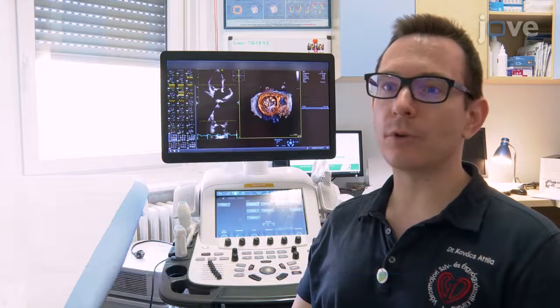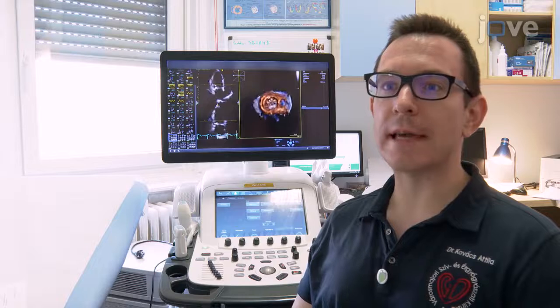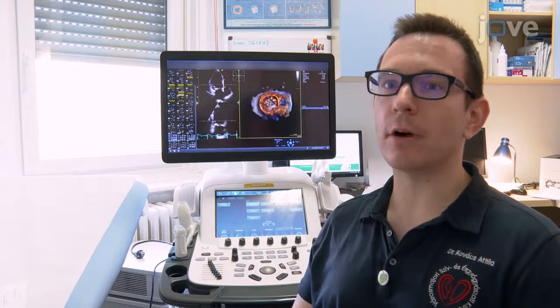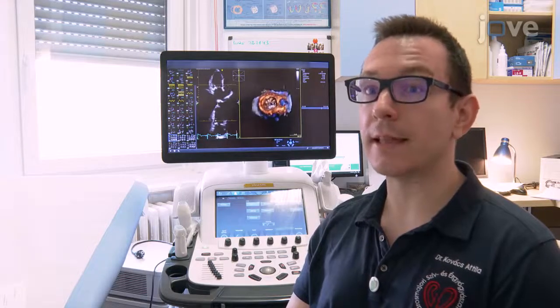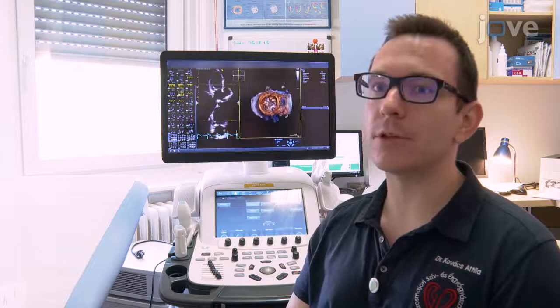3D echocardiographic assessment of cardiac structure and function is a breakthrough innovation in cardiology. Quantification of left ventricle morphology and systolic performance is the single most important step in every echocardiographic protocol. 3D echocardiography-derived left ventricular volumes and ejection fraction correlate most closely with gold standard cardiac MRI and have shown to be more reproducible compared with conventional 2D techniques. More accurate results turn into more tailored therapeutic decisions and, ultimately, better patient outcomes.